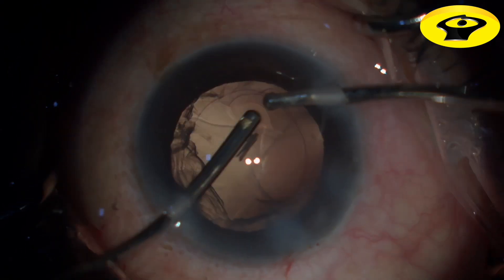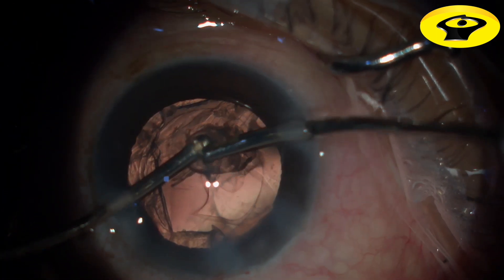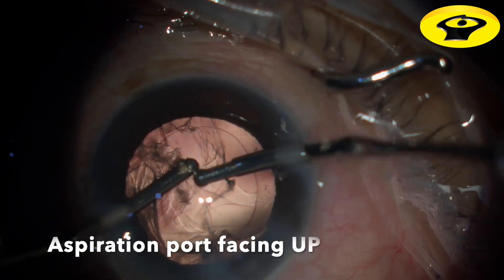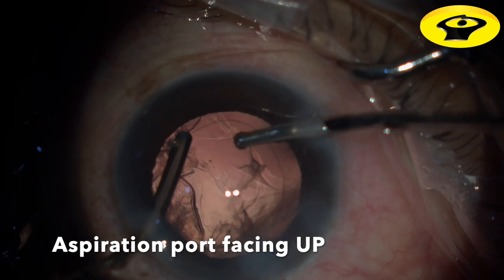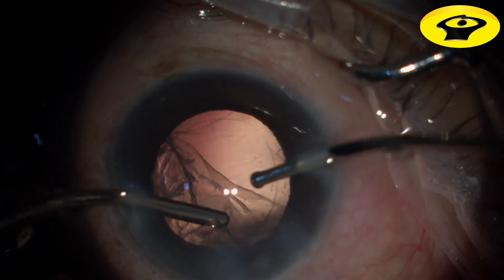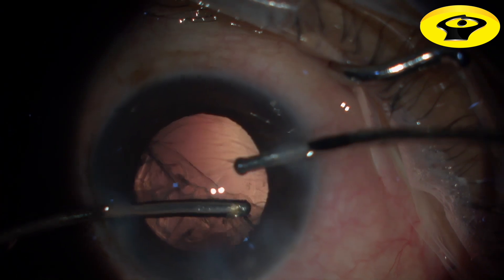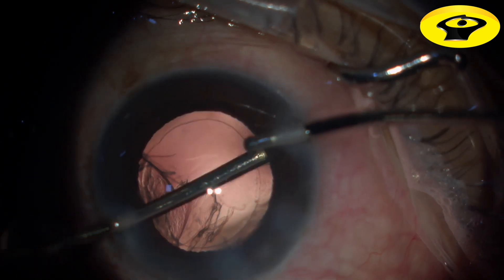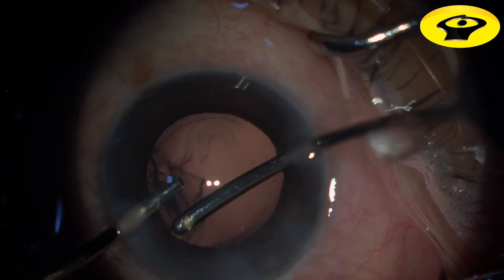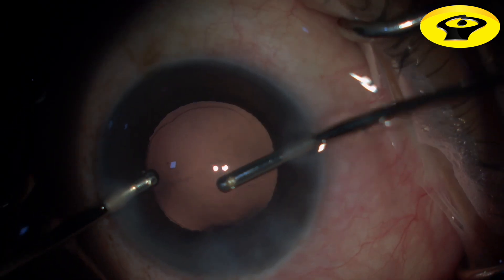Bimanual irrigation and aspiration is done where the irrigation is kept on one side of the side port and aspiration of the cortex starts quadrant by quadrant. The aspirating port should always be facing upwards. When you finish aspirating one half of the cortex, you can shift your hands. Before that, a little epithelial wash is done to prevent capsulophimosis. Sub-incisional cortex aspiration is very easy with bimanual aspiration.